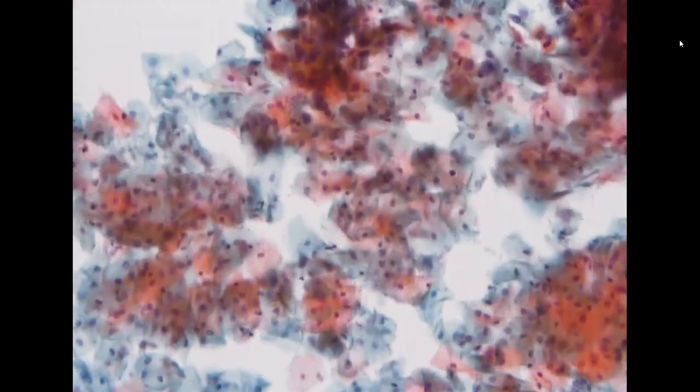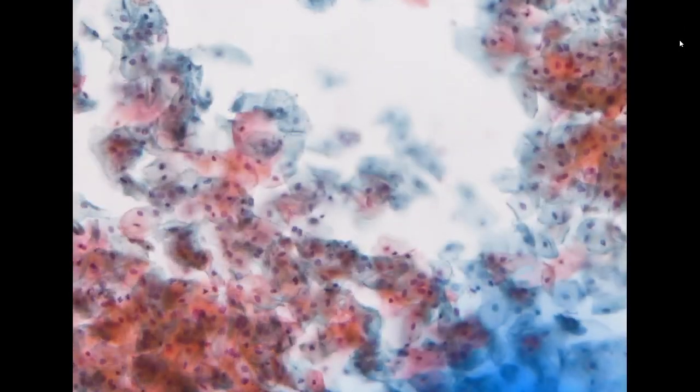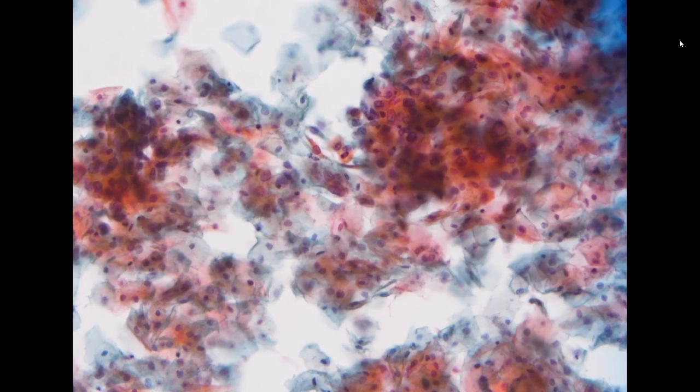Sometimes there would be discrepancy between pap smear and colposcopy biopsy, because the lesion is too deep or because the lesion is very tiny and it's not easy to be inspected by the clinician. So sometimes you need to have a couple rounds and then have a definite biopsy. So for this specimen, I'm still calling this CIN2.